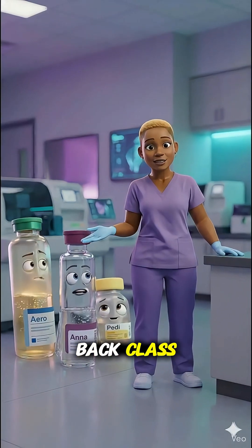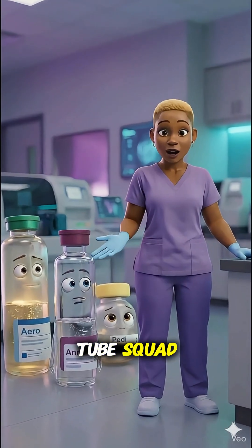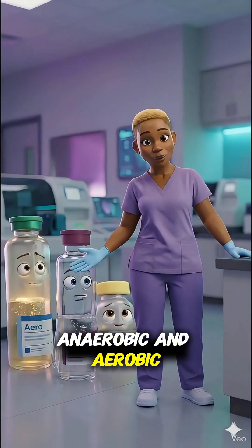All right, welcome back, class. Today we're meeting some very important members of the Tube Squad. These are the blood cultures, anaerobic and aerobic.